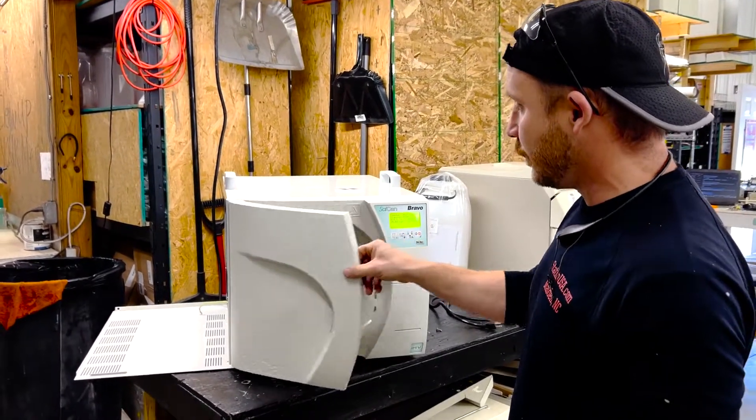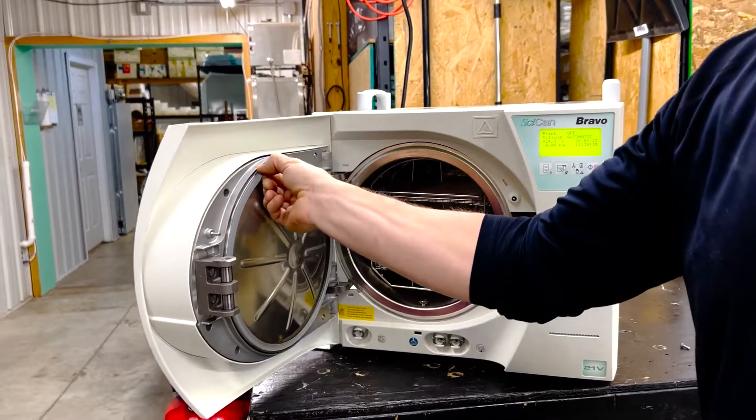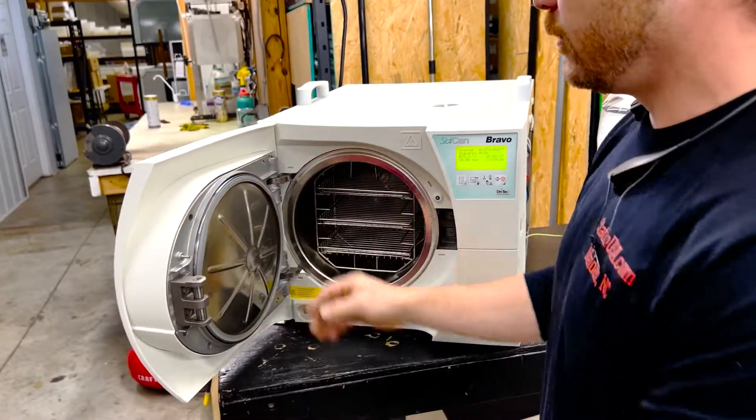Let me show you a couple features. Here's the door gasket right here — very easy to replace. It should be replaced every 500 cycles or six months. We do videos on how to replace that door gasket and talk you through it real easy.